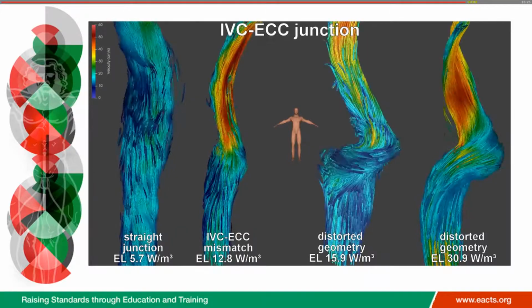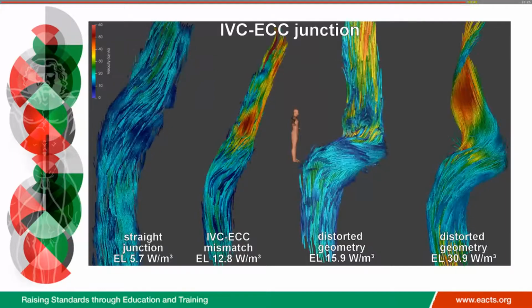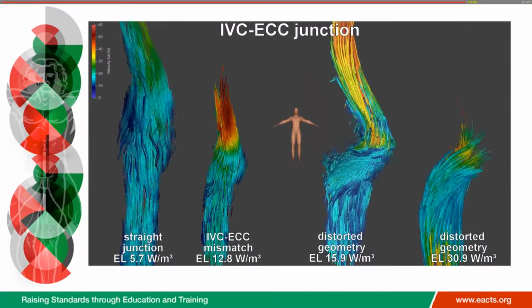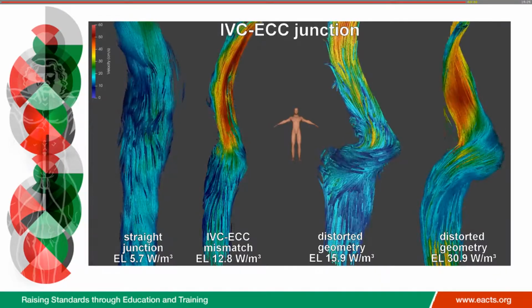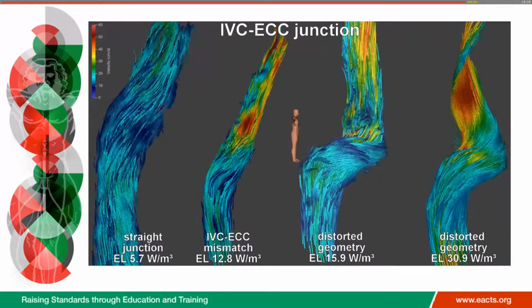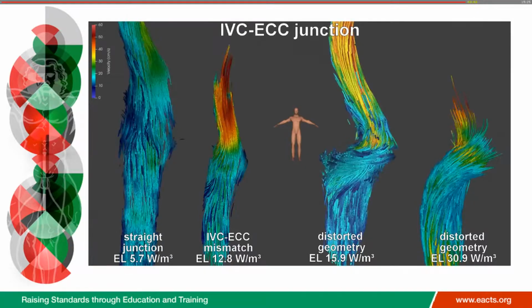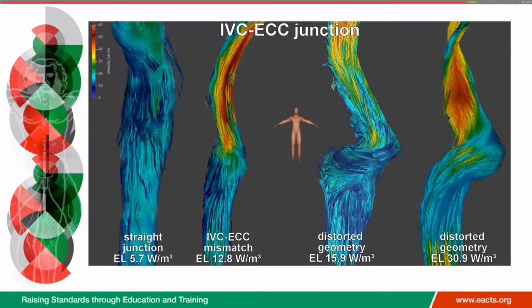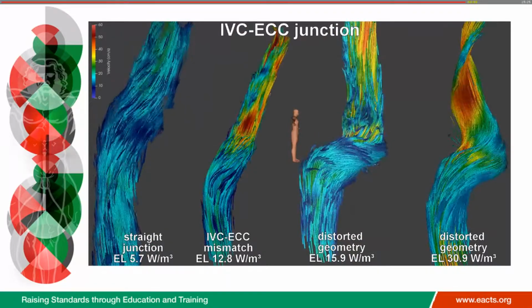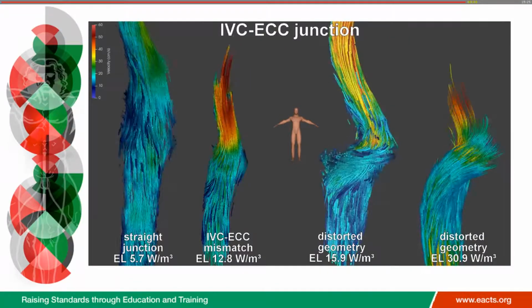Whether this is important clinically, I don't know, but the point is, someone made a suggestion at Eve that we should look very carefully at matching the conduit to the caval size somehow. And unfortunately, the anthropometric data that we have for normal patients doesn't seem to apply to univentricular heart patients, and it's quite difficult to get this number just right. You could say maybe it's not clinically important, but of course with the Fontan patients, everything is clinically important. Yeah. But very nice presentation.